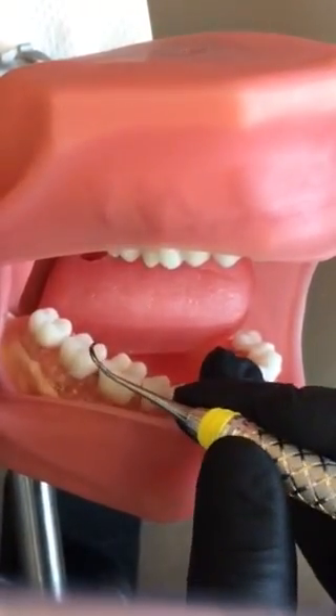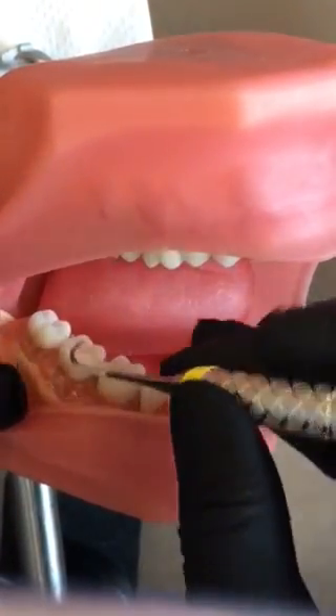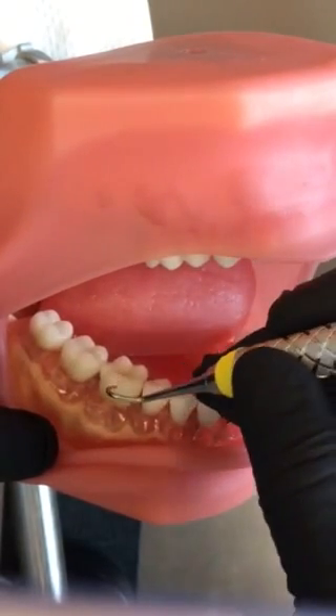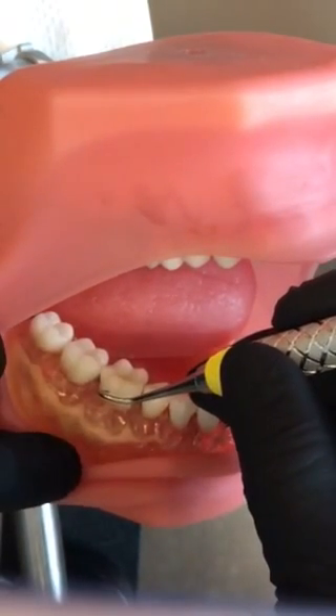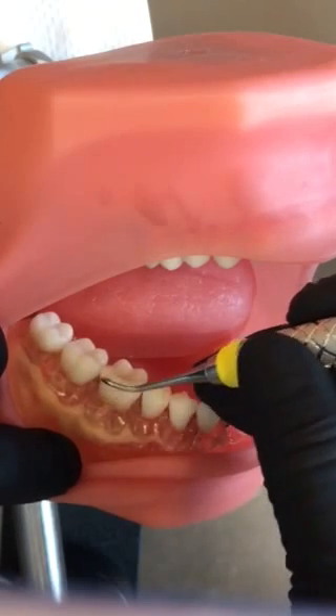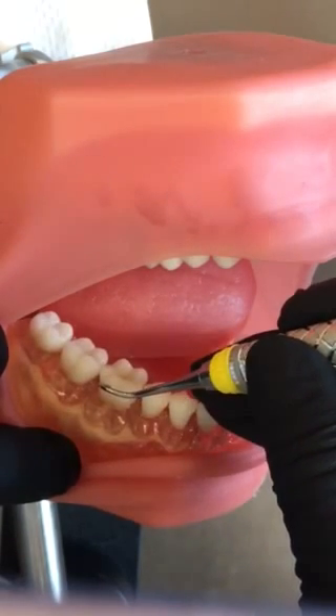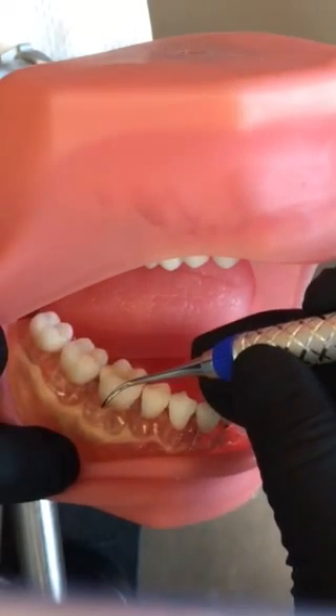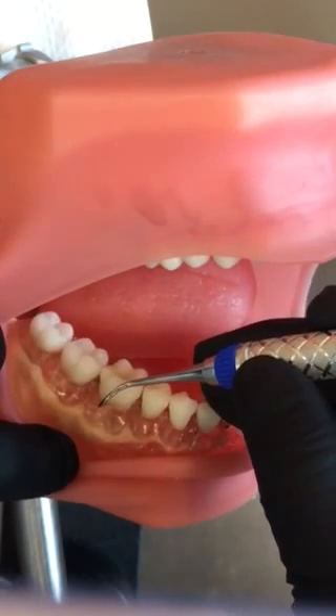Your NEVI 3 Scalar is a posterior scaler. We're going to choose the correct working end by establishing our fulcrum, turning the tip toward the tooth, and seeing which end has the most parallel terminal shank. You can see this end is laying across the tooth, and this end is parallel — so this is the correct working end.